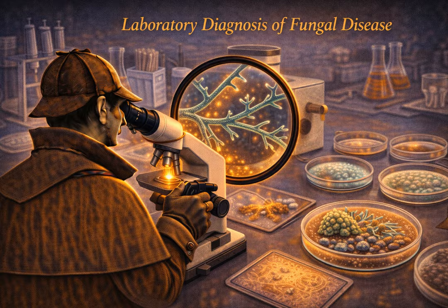This brings us to specimen collection. And reading Murray, it seems like there are two major ways to completely mess this up before you even get to the bench. The first is contamination. This is a massive headache in clinical mycology. You have to remember, fungi are ubiquitous. They are in the air we are breathing right now in this room. They are on your skin. They are on the hospital tray. If you leave a piece of bread out, mold grows on it. That mold came from the air.